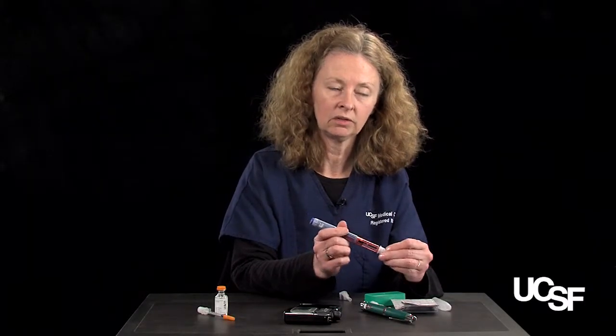That is how the insulin pens work. It's important to use them correctly because you can get incorrect dosing if you don't follow all of the steps. People really appreciate using the pens because they're easy.